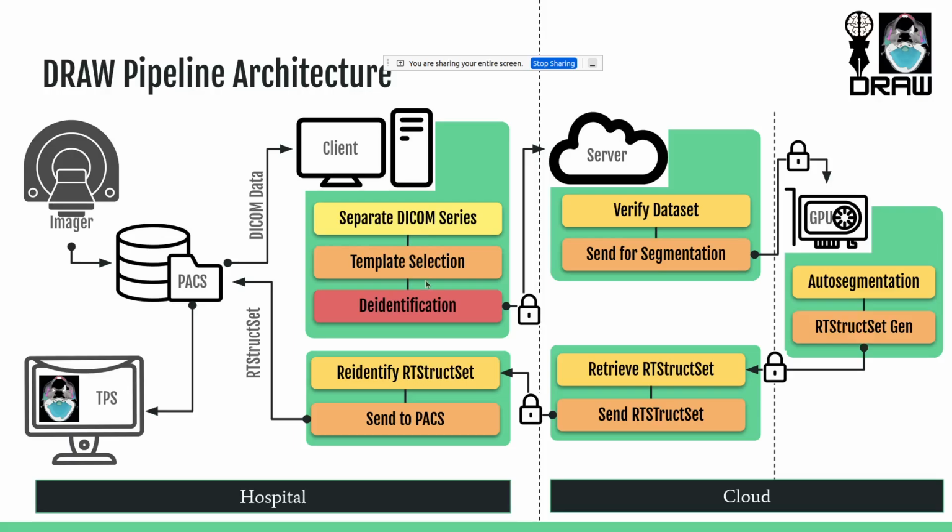After this has been done, the system will de-identify the data. It will strip out identifiers like patient ID, patient name, address, phone number, email, the doctor's name, institution address, and all the study specific unique identifiers. So DICOM has a set of identifiers with each series, like the study instance ID, series instance ID, SOP instance ID. All of these IDs will be changed by the system. What happens as a practical result is that effectively this DICOM study cannot be used to identify the original patient after this.